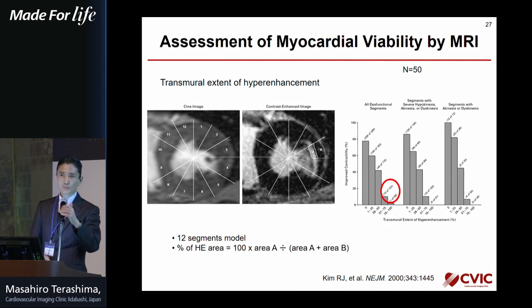Using this late gadolinium enhancement, a large population of myocardial viability can be assessed by cardiac MRI. This is a very nice study published by Raymond Kim in 2000. More than 50% enhancement indicates that the myocardium is very unlikely to recover after the intervention or any revascularization procedure.